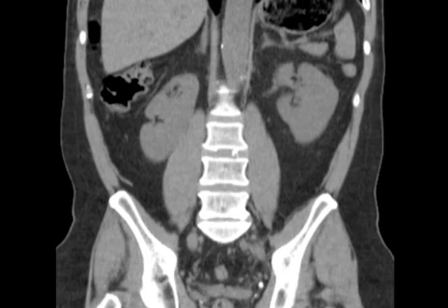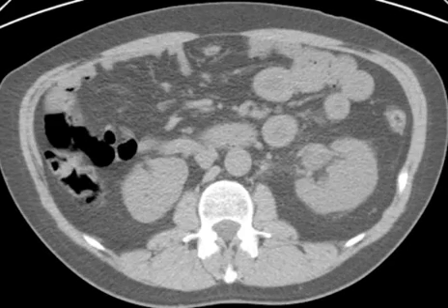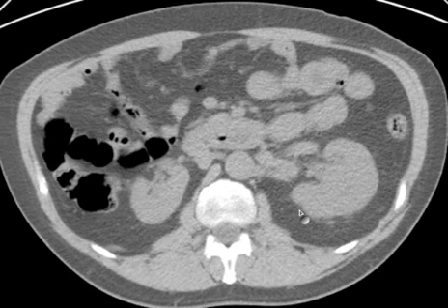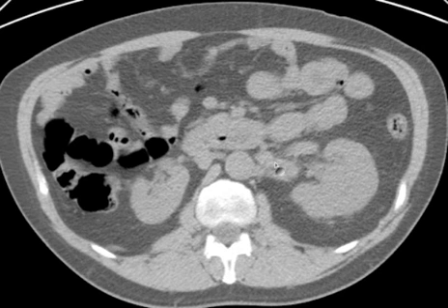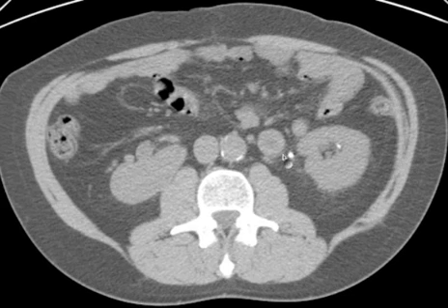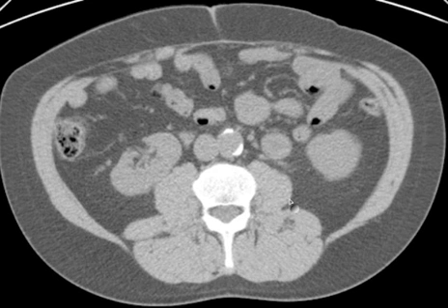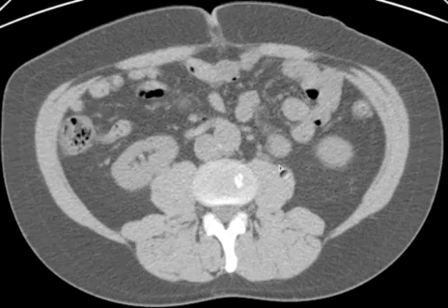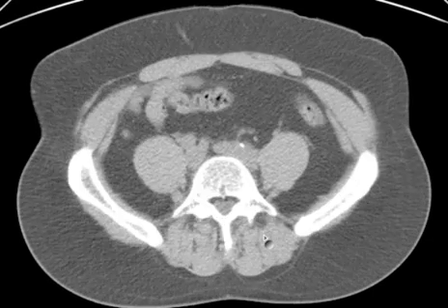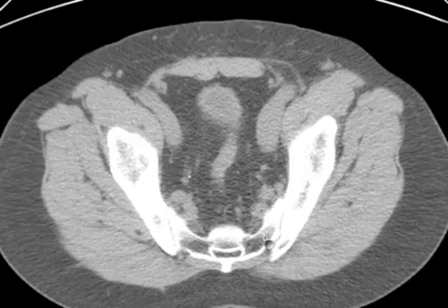Another point: get comfortable with following that ureter. It can be hard, especially if it's not dilated. You have to get used to looking in this messy situation in the renal hilum, sorting out where the ureter is actually coming out. This looks like it has some renal artery and renal vein in there. There's still a pouchy-looking renal pelvis — follow it down — there's the stone in the UPJ. Can you follow it distal to that? It's so collapsed, but it is here somewhere. Very hard to find, but keep working on it. Keep trying to find that ureter and follow its course as far as you're able. This would be a really tough one because of the proximal obstruction. Renal malrotation.